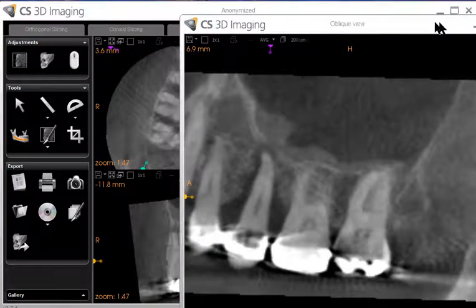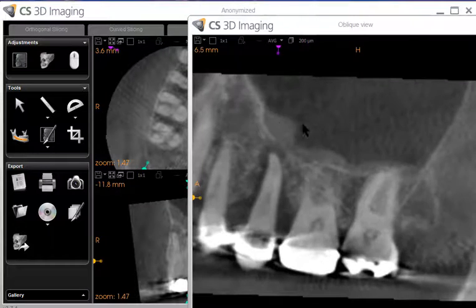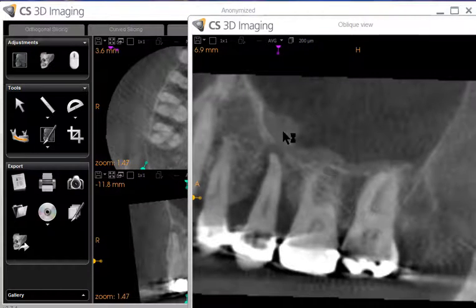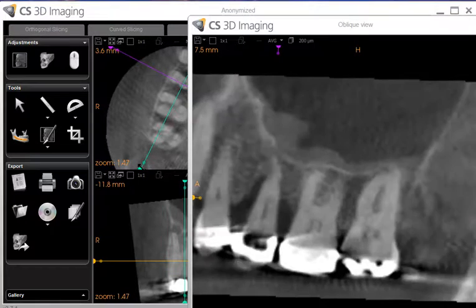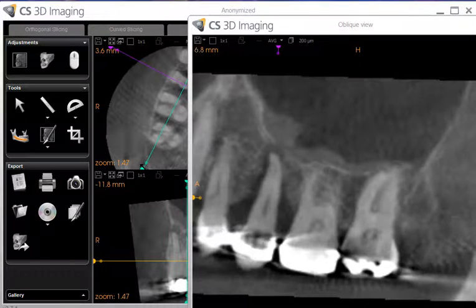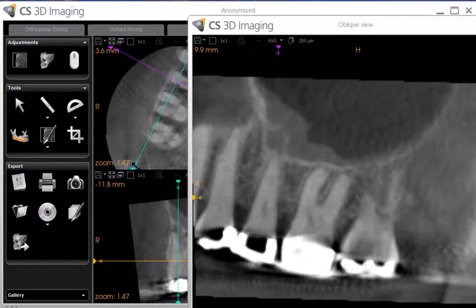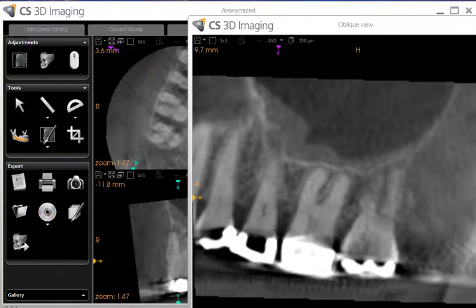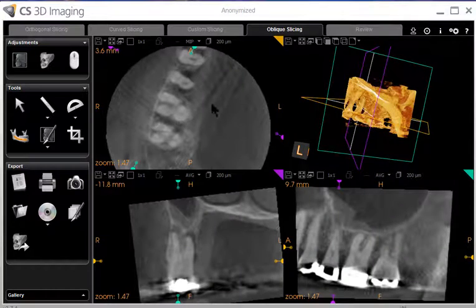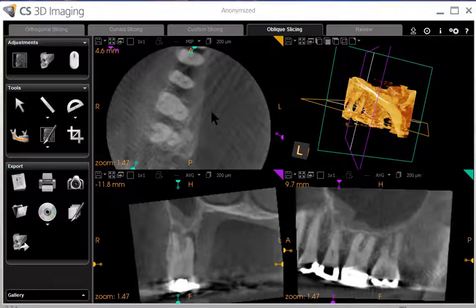As I scan through it, you can see the bone loss all up and down on the palatal root, whereas in the buccal root it has a periapical lesion but we don't have bone loss all along the root.